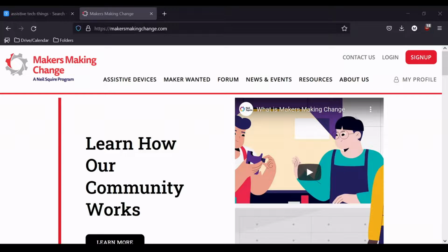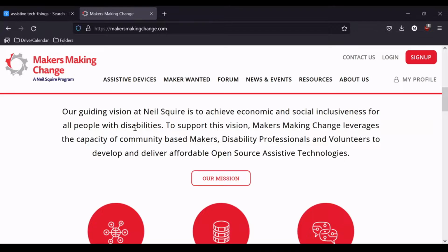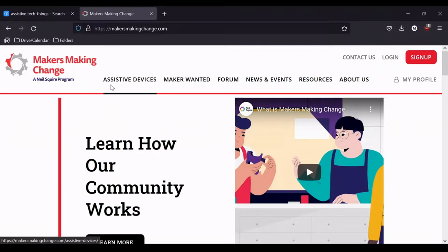So another website that you might want to consider is a website called Makers Making Change. This website is a lot more specific in terms of what's available, with all of its designs being assistive technology. Unlike Thingiverse, the library of designs isn't on the front page, but you can come over here to the tab that says Assistive Devices, click on that, and you'll be directed to their library.